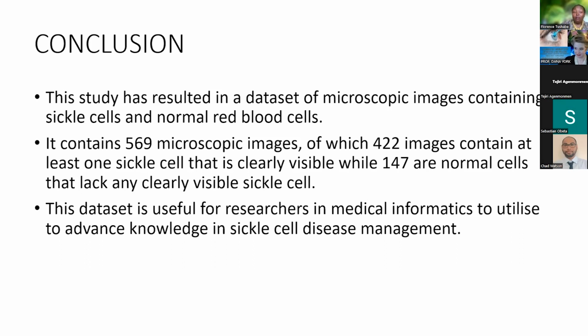We have lab technologists in the labs. They can just take the slide, and even in some health centers in Uganda that don't have lab technologists, they have midwives, nurses, and doctors. These can do the staining, and then we use this to say that this is a sickle cell or it is not.